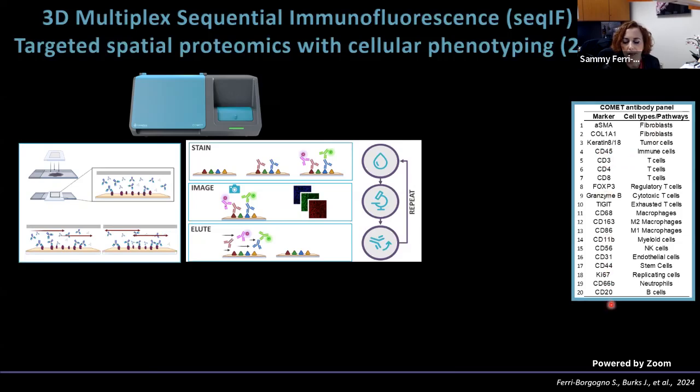areas. And the remaining 17 markers were chosen to phenotype each different cell type that could be present in the tissue. So each cell can be phenotyped, and we can have a specific phenotyping for all of these cell types. So basically, the way the Luna-4 works is that 2 antibodies are utilized at the same time at different species. There is an incubation step, and then an imaging step, and then an elution step, and then the cycle is repeated until all of the 20 antibodies are used.